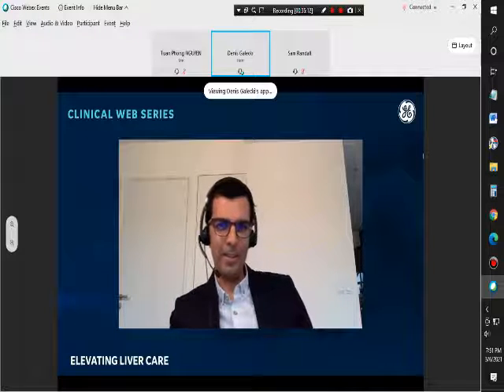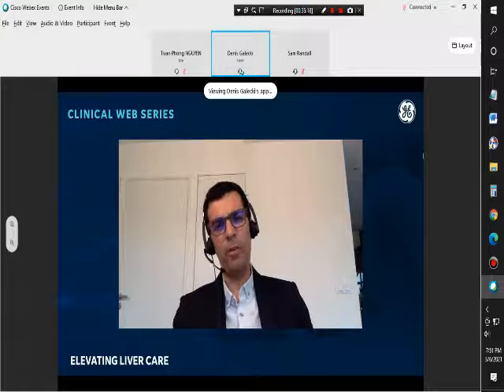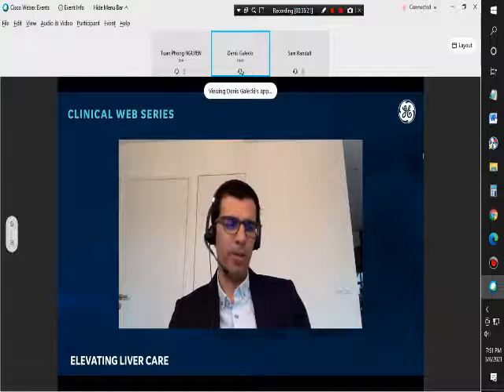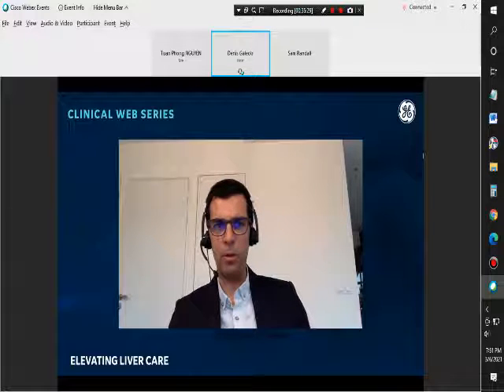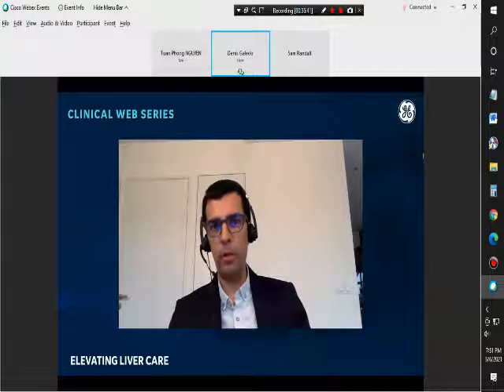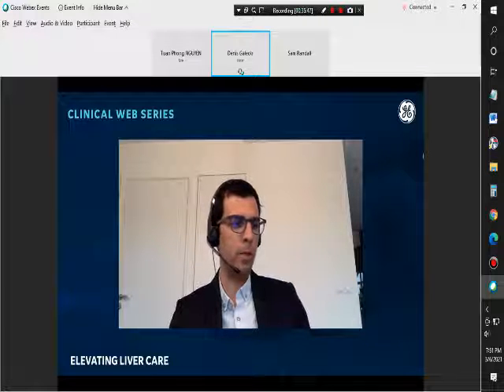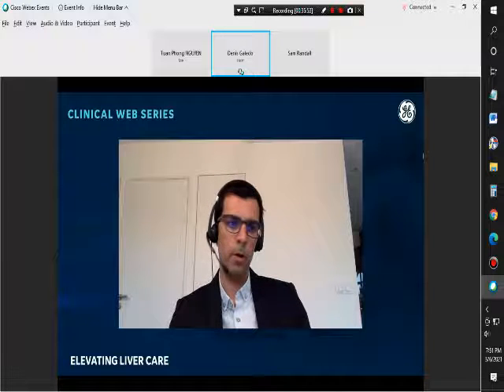Yeah, it's an interesting question. Hopefully, it's not often the case. In many patients, you don't have a clear heterogeneous distribution of the liver fat content. In these patients, usually I perform the measurements where the quality of the ultrasound image is the best. So I don't try to target a specific area. We just go where we think that we will be more reproducible.